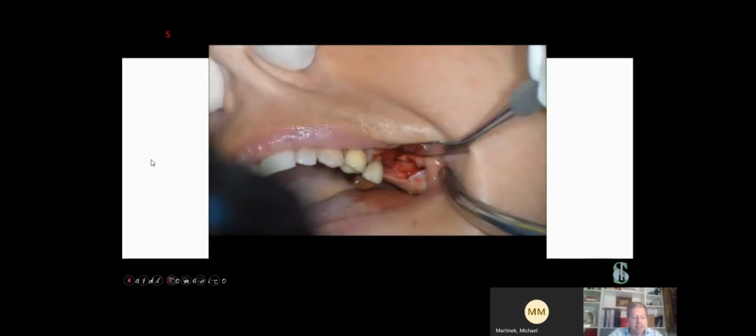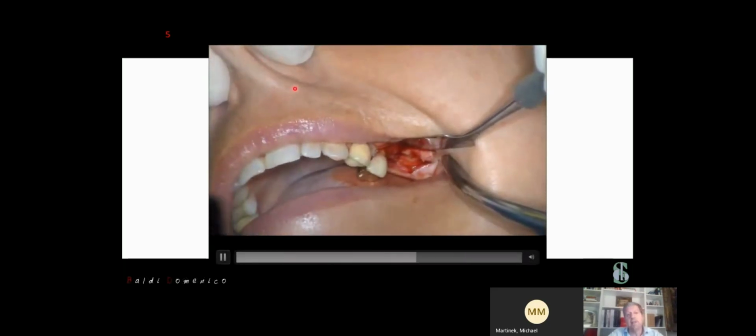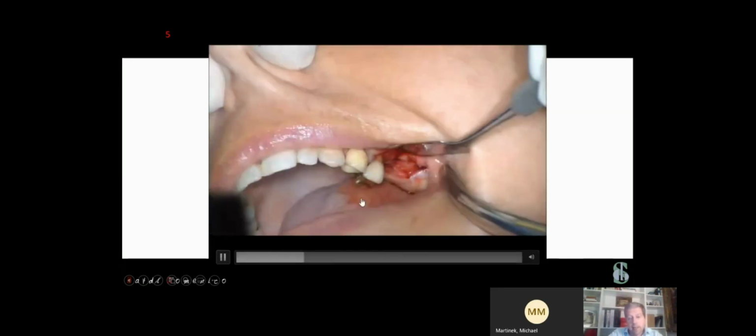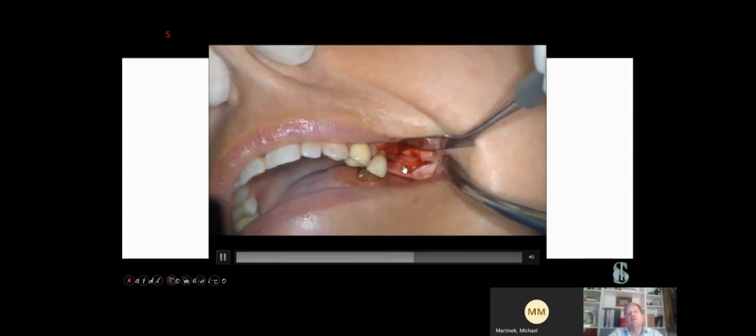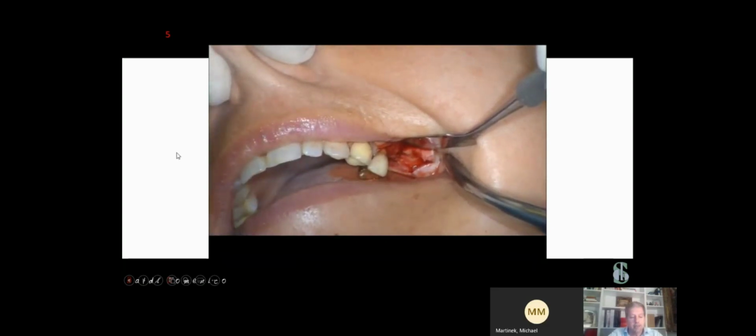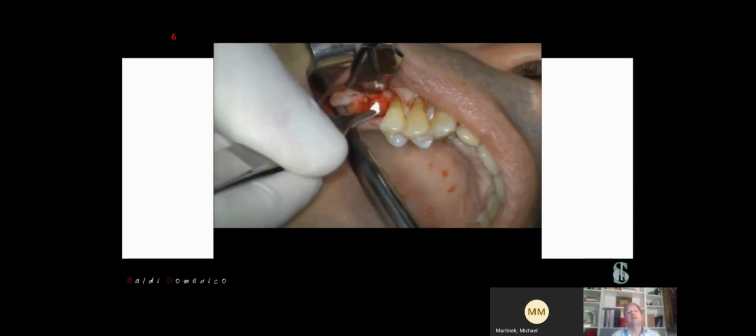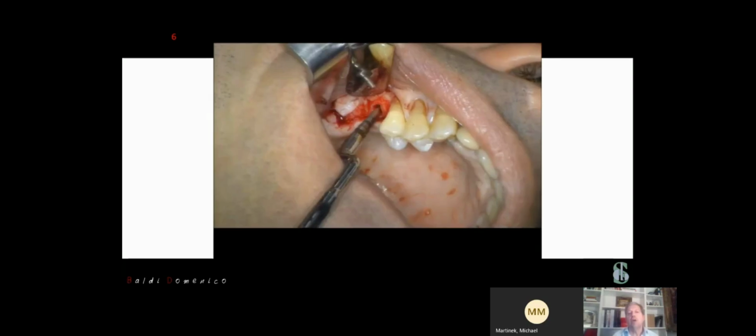You can do the Valsalva maneuver in order to see if we have a perforation of the membrane. And I suggest doing it also if you use the magnetic mallet. Now you can start to make the elevation.